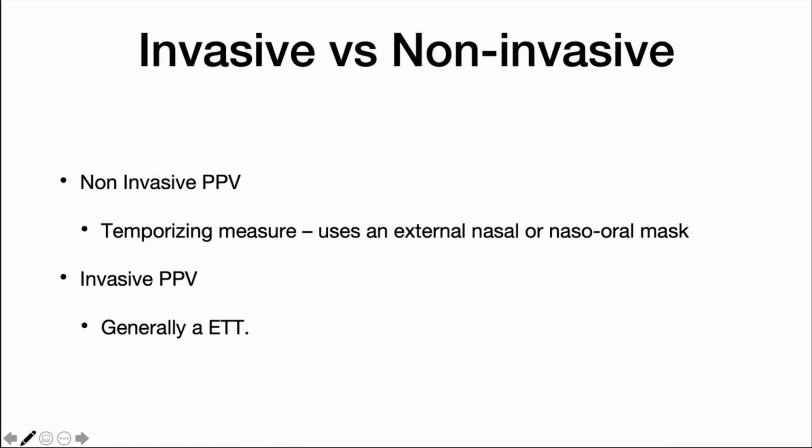Non-invasive positive airway pressure ventilation, or NIPPV, provides positive airway pressure during exhalation, and bilevel modes can apply additional positive pressure during inspiration. Using NIPPV in the setting of respiratory failure, which is caused by either hypoxemic or hypercapnic respiratory failure, is generally considered for patients who have a condition with the potential to rapidly improve the decompensated physiological variables. To initiate invasive mechanical ventilation, we typically need to have in place an artificial airway, such as an ET tube, which will act as the interface with the mechanical ventilator.